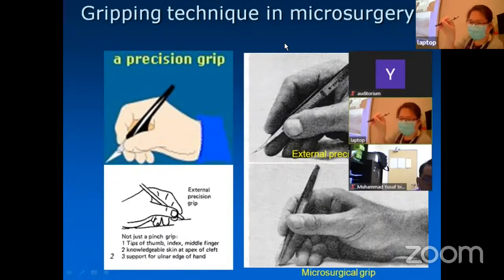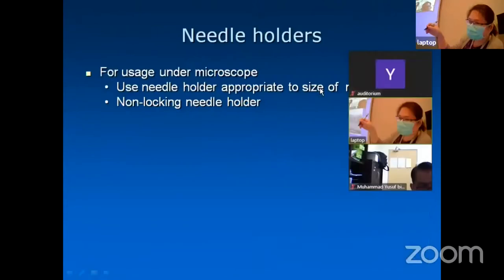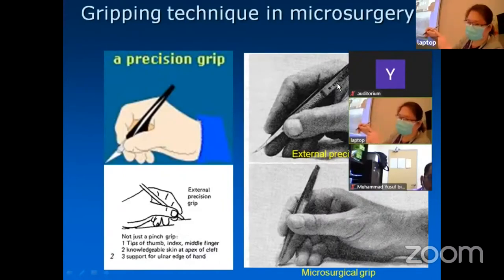External precision grip is more than just a pinch grip. When we talk about a 2-point pinch grip, it's like pinching a pinch of salt. But in an external precision grip, there'll be a 3-point pinch involving the first three fingers. So when you're holding a pencil or your instrument in the external precision grip, the shaft of the instrument is resting on the snuff box. On top of this pinch grip, the instrument will rest and roll if rotated with the fingertips.